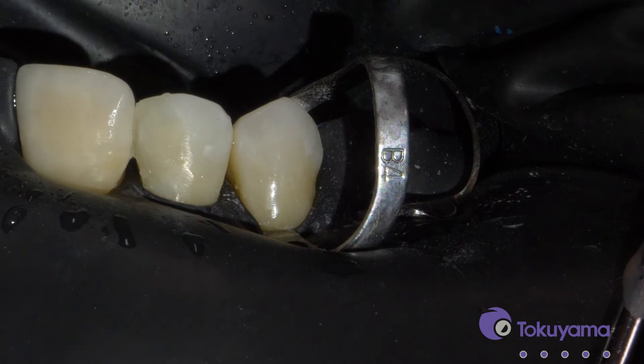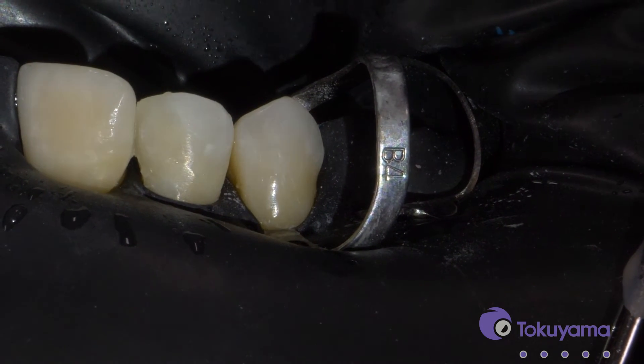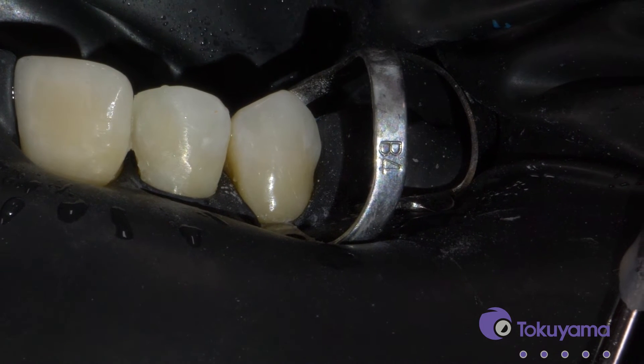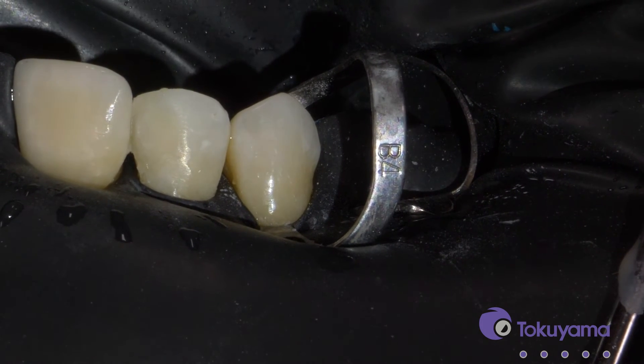So once I've drilled out the void, I'm just going to put a little bit more of that bonding agent. I don't have to etch because I'm just bonding to the composite right now, rather than the tooth.